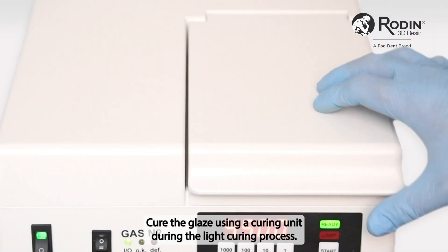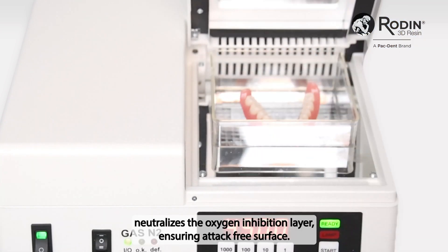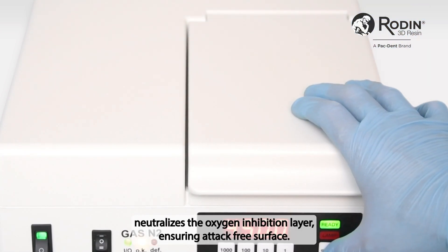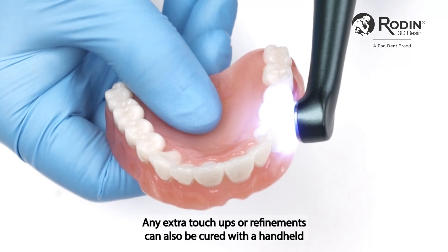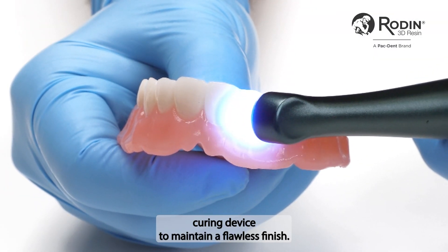Cure the glaze using a curing unit. During the light curing process, the advanced formulation neutralizes the oxygen inhibition layer, ensuring a tack-free surface. Any extra touch-ups or refinements can also be cured with a handheld curing device to maintain a flawless finish.